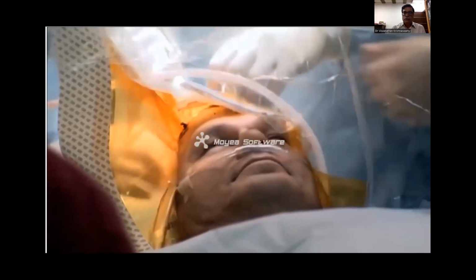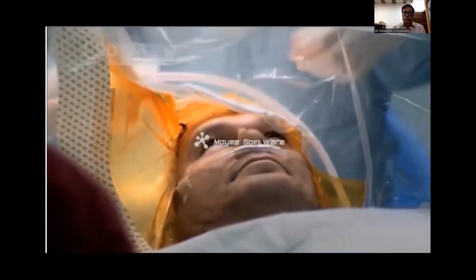Mark's scalp is opened to drill a hole through the skull, ready for the electrodes. Making sure that he's got the entry point and the target perfectly lined up.